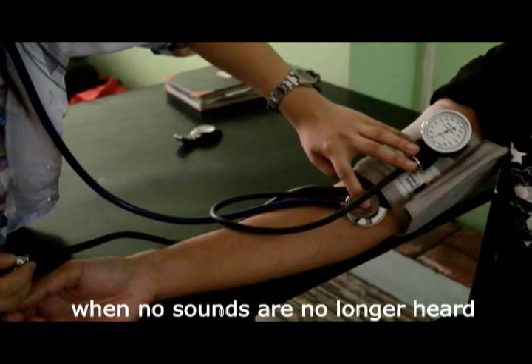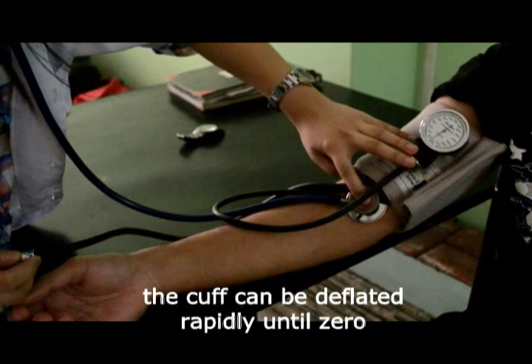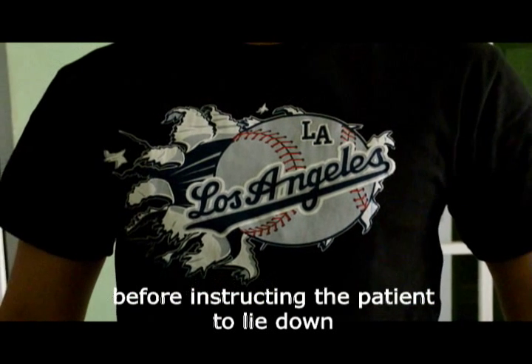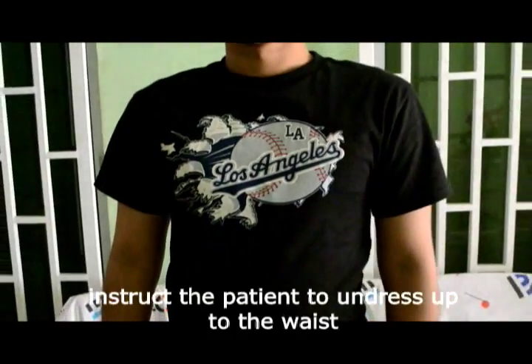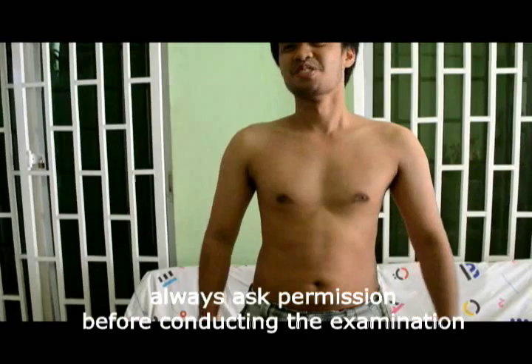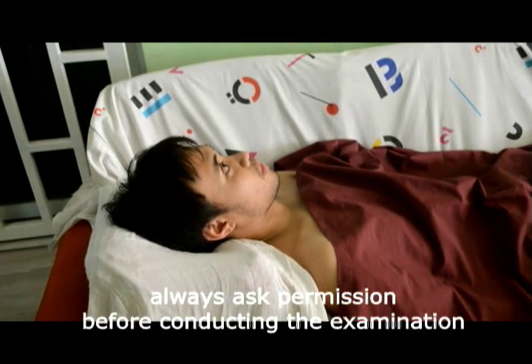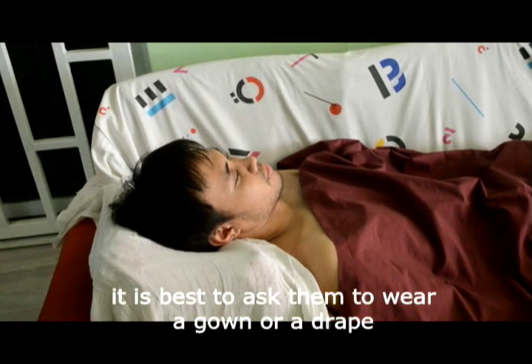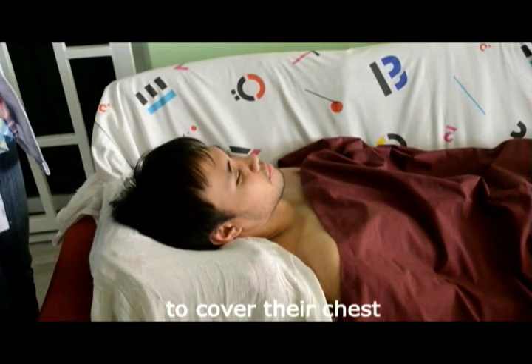When no sounds are no longer heard, the cuff can be deflated rapidly until zero. Before instructing the patient to lie down, instruct the patient to undress up to the waist. Always ask permission before conducting the examination. For female patients, it is best to ask them to wear a gown or a drape to cover their chest.